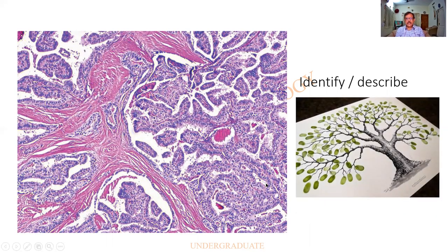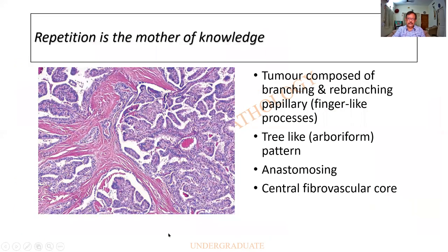Now look at this — it is like a tree, an arboriform pattern. There is a trunk, branches, it branches and rebranches, small twigs, and then the leaves of the parenchyma — it has exactly this kind of appearance. The tumor is composed of multiple branching and rebranching papillary or finger-like processes with a tree-like arboriform pattern, anastomosing in some areas. There is a central fibrovascular core, which we shall see shortly.